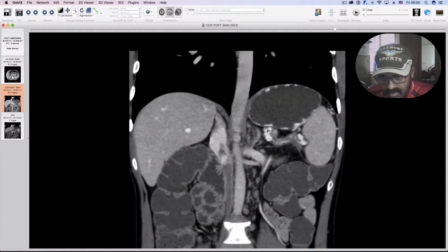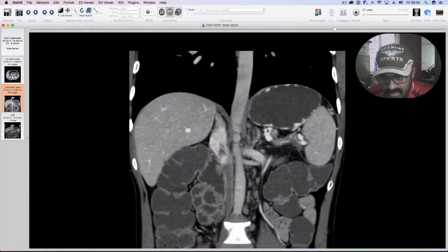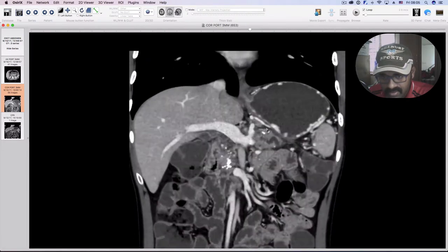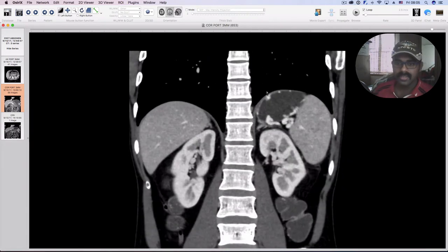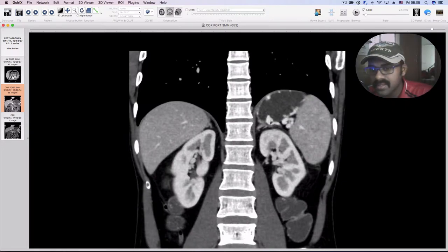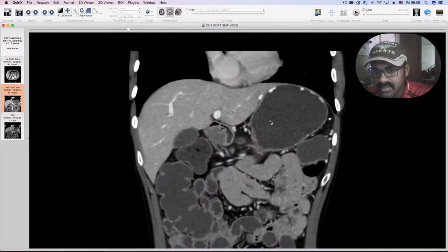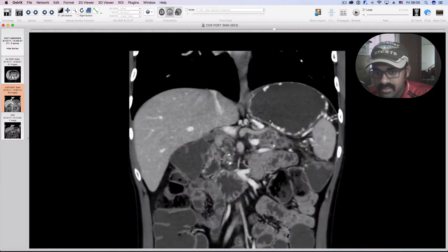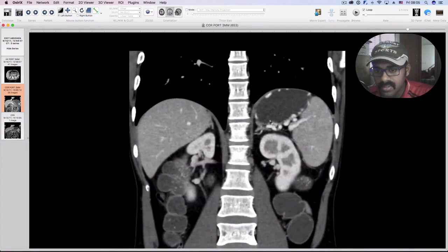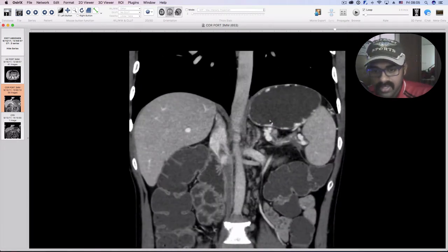Another striking feature is that there are a couple of dilated venous channels seen along the walls of the stomach. These are gastric varices, which probably also need to be worked up to rule out any possibility of hemorrhages or upper GI bleeds later on.